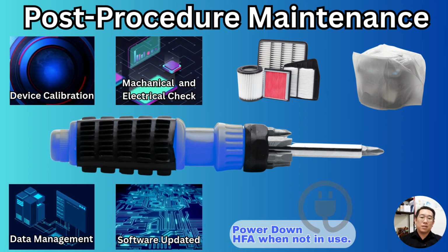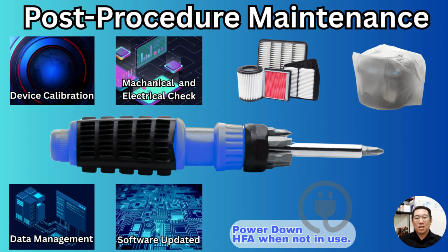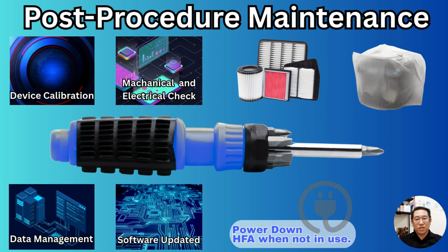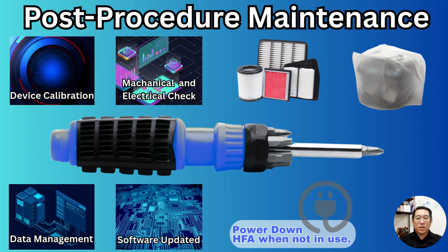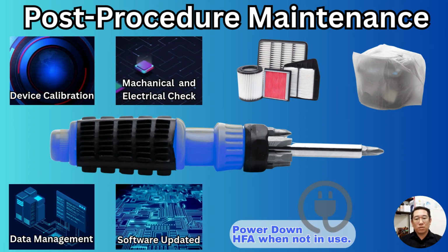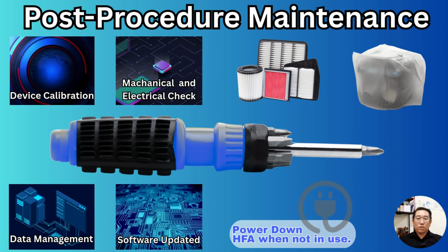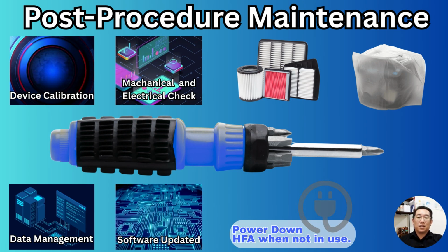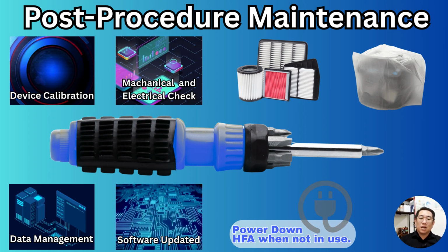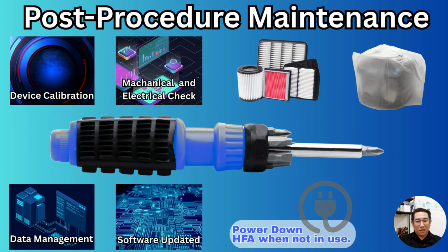The device should be calibrated daily or weekly using the built-in routine, ensuring the bulb's illumination and background brightness match the manufacturer's specification. For data management, all patients' results should be saved and backed up at the end of the day, then exported to the clinic's storage system to prevent data loss. We should also perform a mechanical and electrical check by making sure all cables are secure and undamaged, and that the printer has sufficient paper and ink.